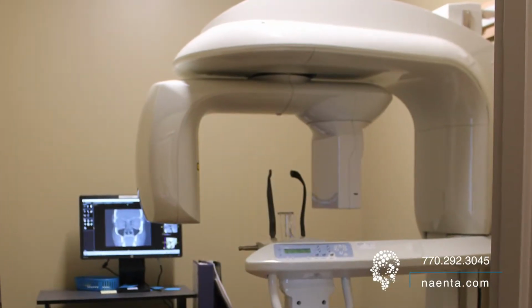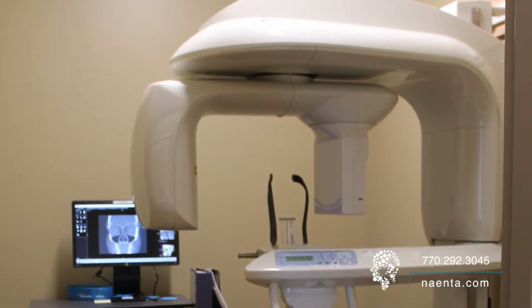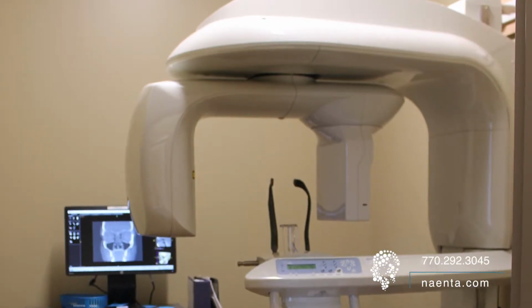We often evaluate the patients with a CAT scan of the sinuses after medical therapy, and we're looking for the sinus drainage area. If it's narrowed, the balloon sinuplasty can dilate that area to help prevent infections in the future. The balloon sinuplasty can be done either in the office under local anesthesia with oral sedation, or often in the operating room under general anesthesia in conjunction with traditional sinus surgery.